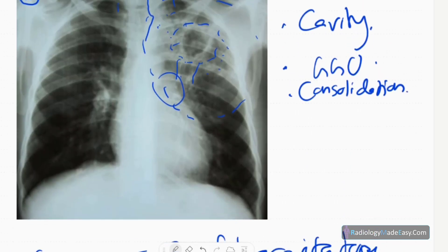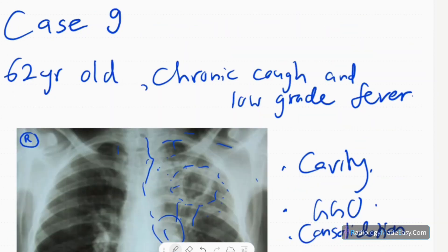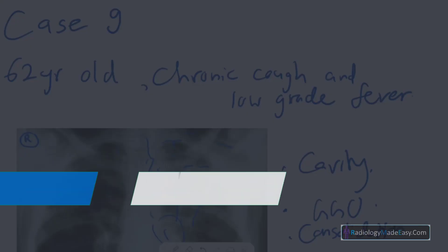Next steps include going for an HRCT chest, or if there is consolidation, a contrast-enhanced CT of the chest to exclude any underlying malignancy. When there is a cavitation, you need to measure the thickness of the wall — if it is thick-walled, it points more toward malignancy.